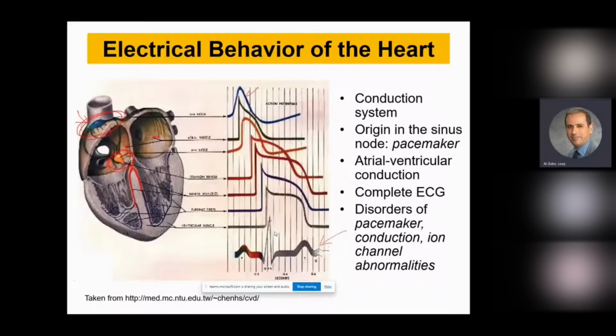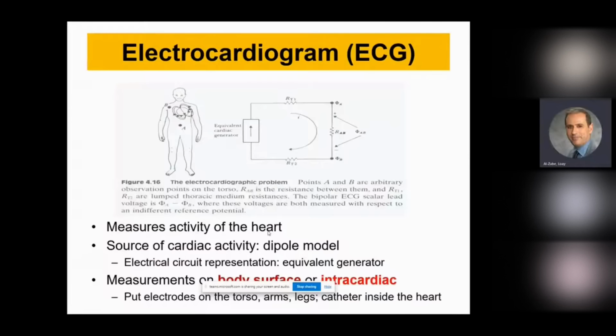In order to come up with this signal in the ECG that the doctors look at, what is this signal? What we would like to understand is that the ECG is actually based on something called a dipole. If you look at the subject at the left, we have here 2 points, point A and point B on the body. This is close to your center of gravity, and this is your right arm.